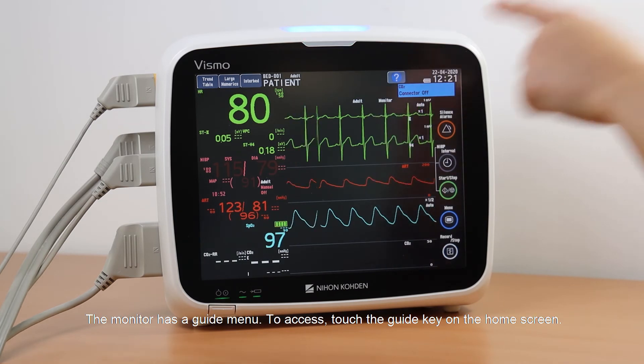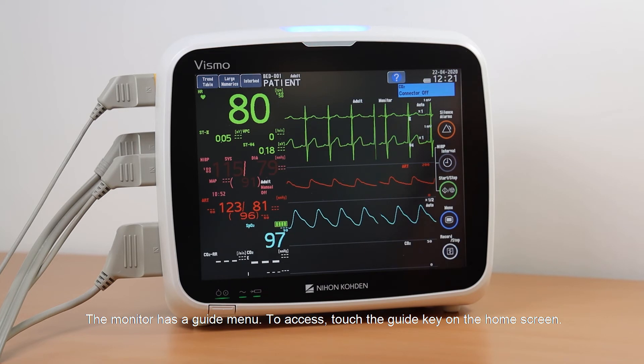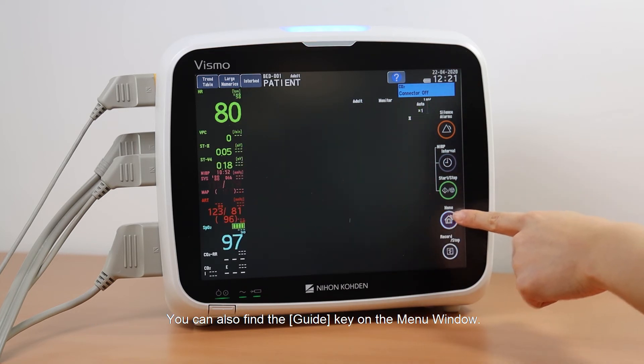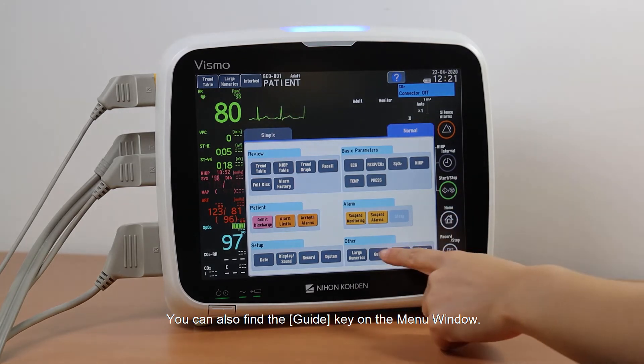The monitor has a guide menu. To access it, touch the guide key on the home screen. You can also find the guide key on the menu window.